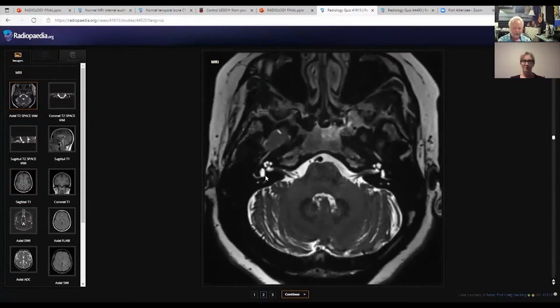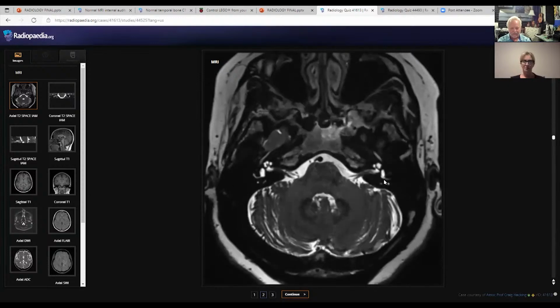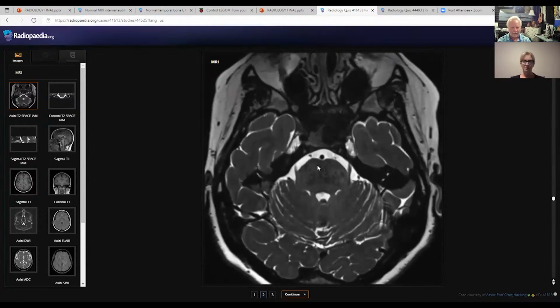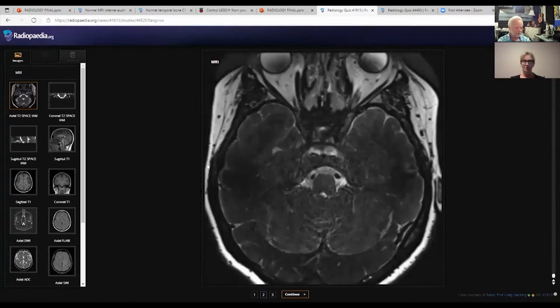And you can see the horizontal canal right here beautifully. Similar structure. Right is always over here, left is over here, and you see the corresponding structures here. You go up a little higher, you see some of the other nerves. This is the trigeminal nerve as it leaves. This is the basilar artery. The arteries silhouette out too, because even though they're full of blood, the blood is moving, and that prevents it from showing up as well. So vessels will look like dark lines as the blood flow is moving.